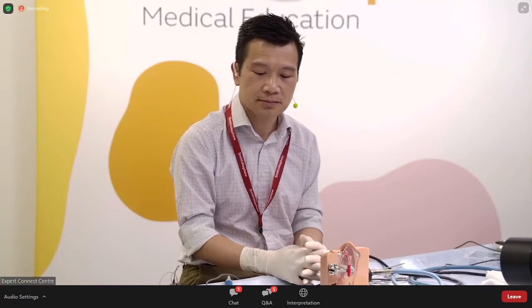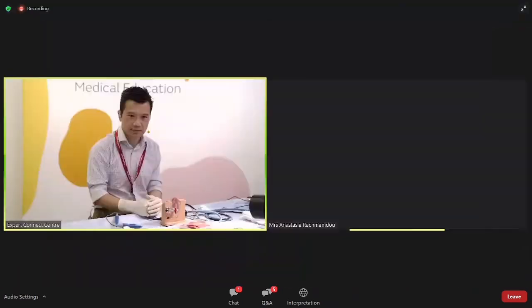I have a slightly different experience in the sense that sometimes you get a little clot. You don't have suction, but you might get a little clot. And if that stays at the tip of your wand, the Reflex 45 then becomes ineffective. And that's why I say clean it, dip it in the gallipot, make sure it is glowing. If it is glowing, it's fine, you can carry on. If it is not glowing, just wipe it with a wet swab. It needs very gentle handling, and it works very well. It doesn't need a lot of effort or scratch pads, but it might have a little clot.